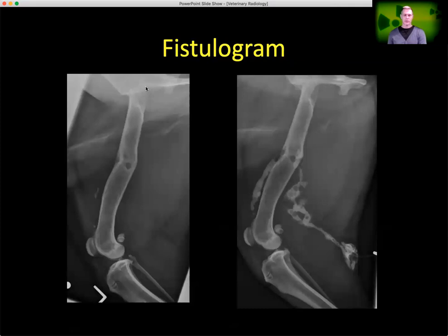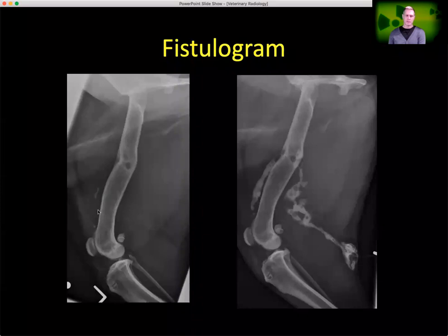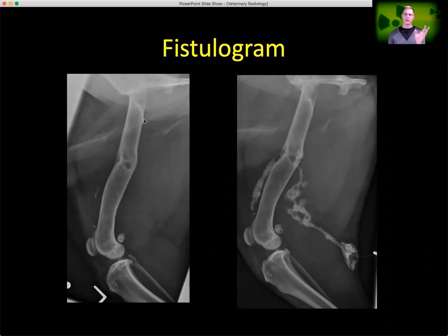Here we have a dog's leg, and the history on this dog is that he broke it a while ago, and you can see that it doesn't line up quite right. It's healed, but it's not healed straight, and that's okay. And it has some holes in it, and maybe there's some mineral in the soft tissues around it. But what we were seeing clinically is this dog had a recurrent infection, and there was always some pus draining out of this dog's leg. And we wanted to know if it was related to the broken femur that it had had in the past.